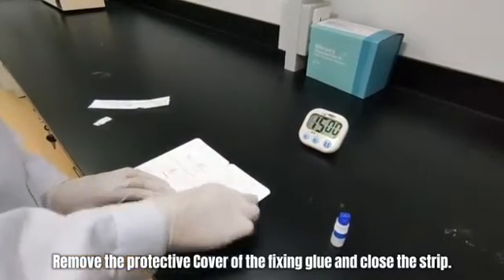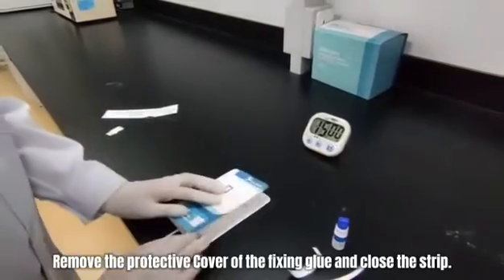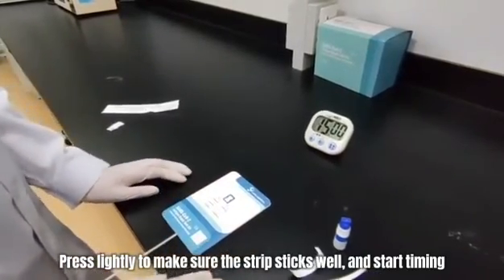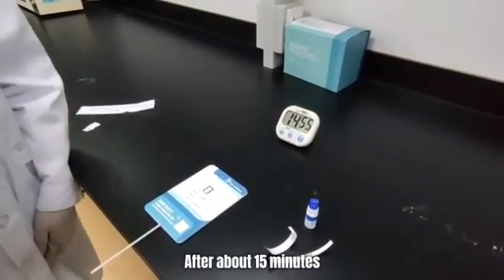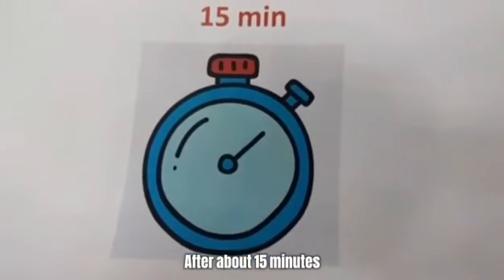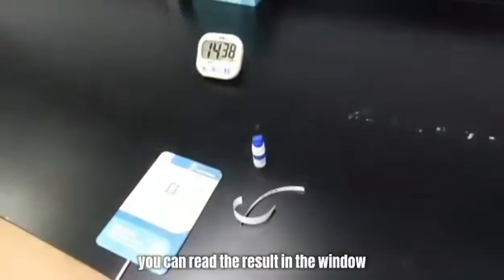Remove the protective cover of the fixing glue, and close the strip. Press lightly to make sure the strip sticks well, and start timing. After about 15 minutes, you can read the result in the window.